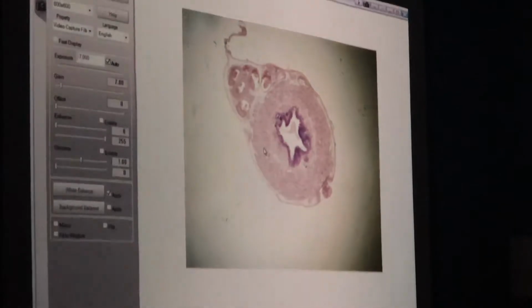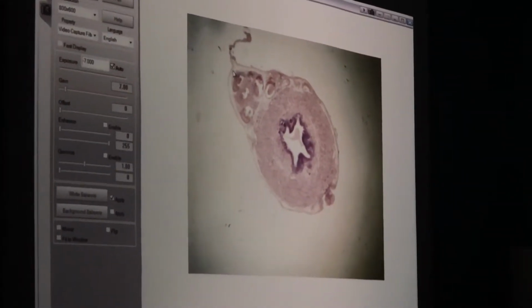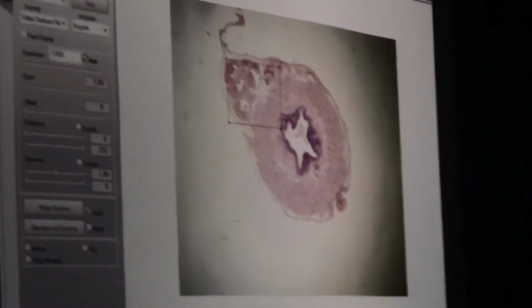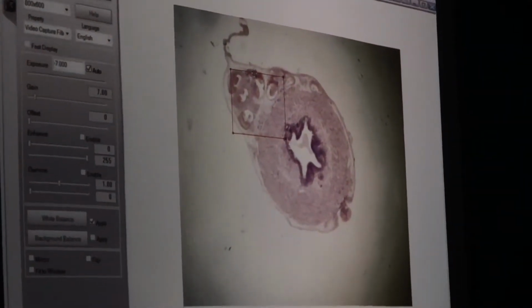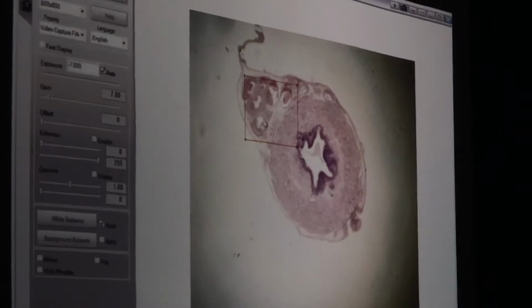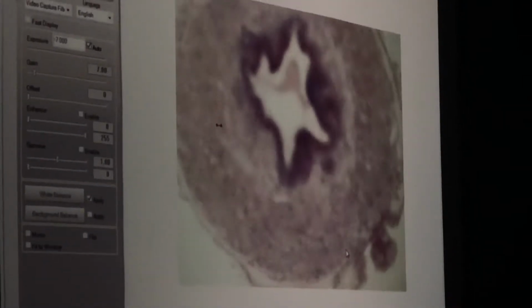The epithelium. Yep, so we're not going to have transitional epithelium. The other thing that you might notice here is look at all of this stuff. What do you suppose this stuff might be? There's some connective tissue there. Blood vessels? Blood vessels, arteries, maybe arteries, veins, nerves. What is that probably? Spermatic cord, very good.